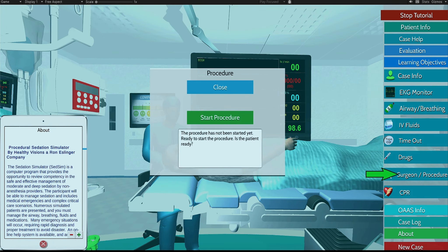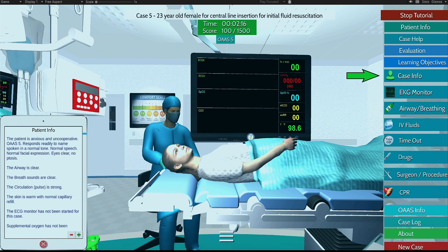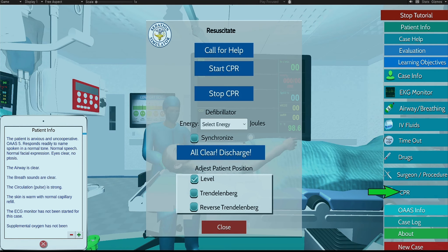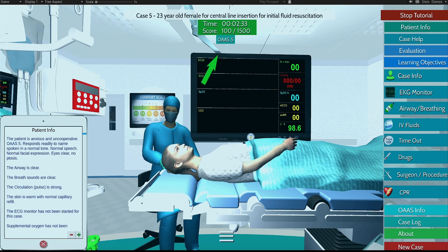This icon is to start your patient's procedure. An OAAS 3 or below is required to start the procedure. During your patient's procedure, continue to monitor your vitals and case info — you may be required to perform additional tasks to successfully complete the procedure. This icon is used in the event your patient requires CPR. This is your case time and total score. You must have a thousand or more points to successfully complete your patient's case. This is your patient's current OAAS level. Contact us if you have any questions.